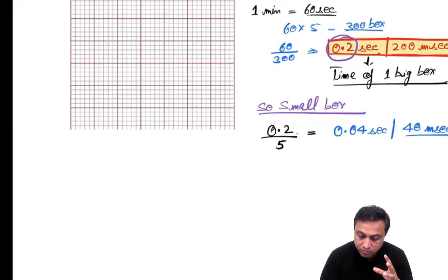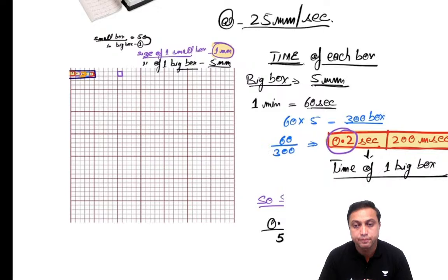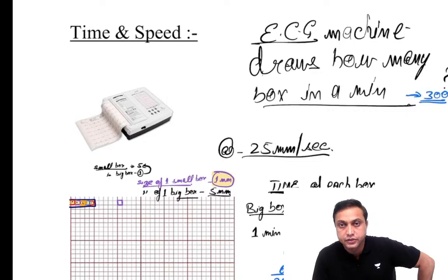If you know this simple calculation, mathematics, ECG is going to be a wonderful tool for you to solve so many questions and to diagnose so many critical things. Right? Let's quickly revise what we have learned till now. We were talking about the time and the speed.